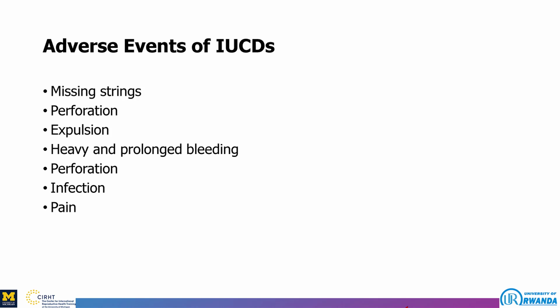Sometimes, due to incompetency, there can also be expulsion of the device, especially when it is not properly inserted. And we may have incidents of heavy and prolonged bleeding.